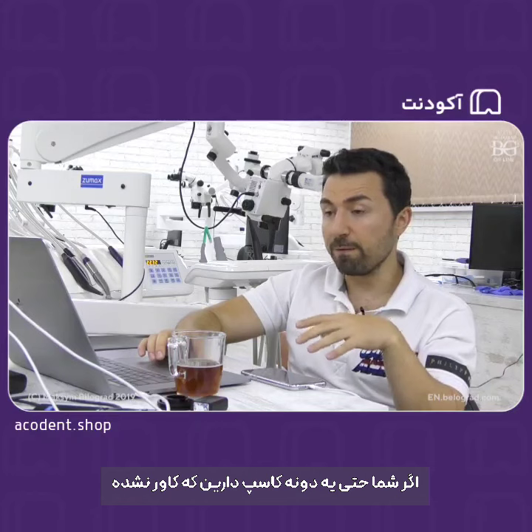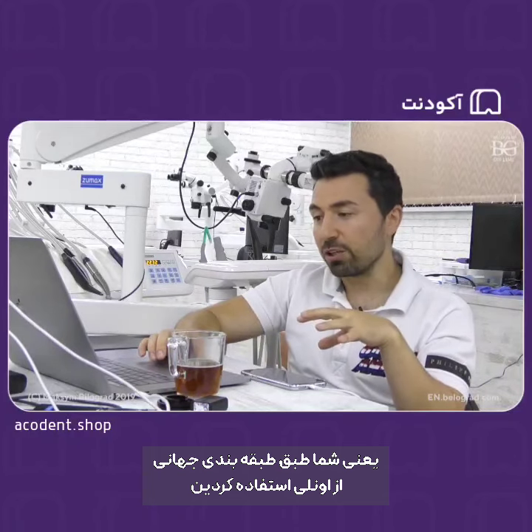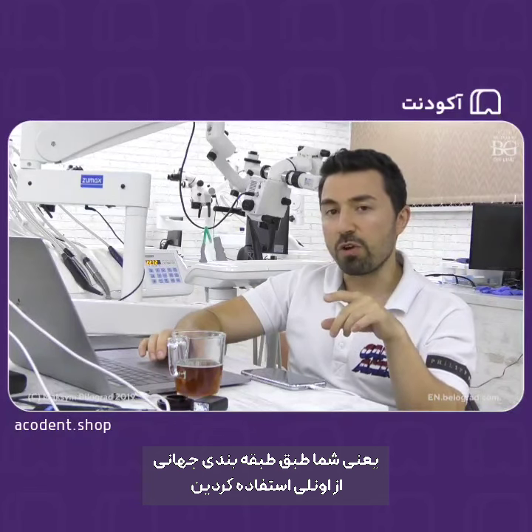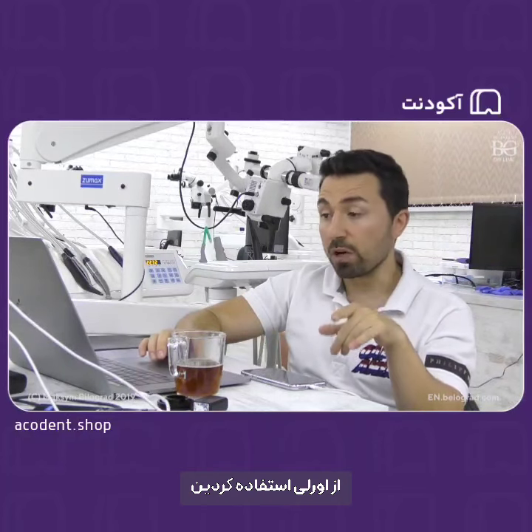So if you have even one cusp uncovered, that means according to the international classification, this type of restoration is onlay. When you cover all the occlusal surface, this type of restoration is overlay.